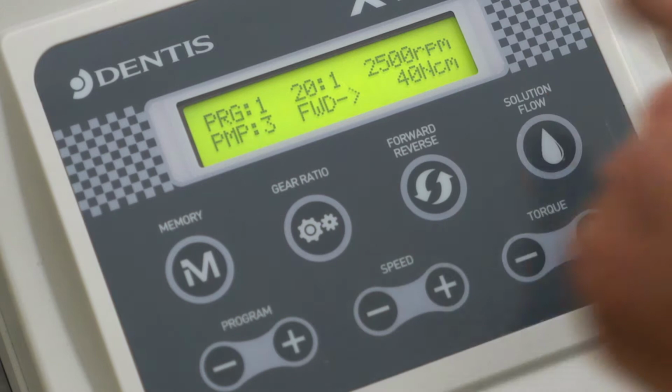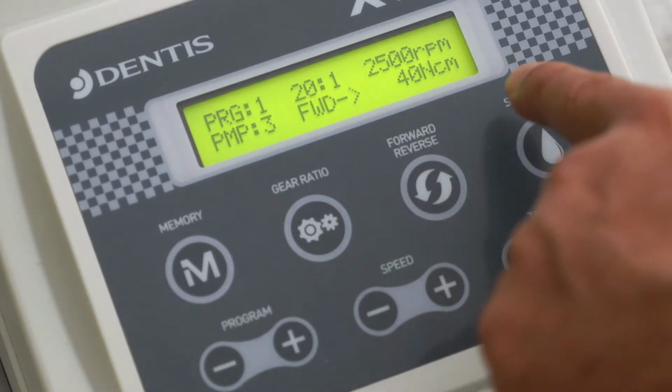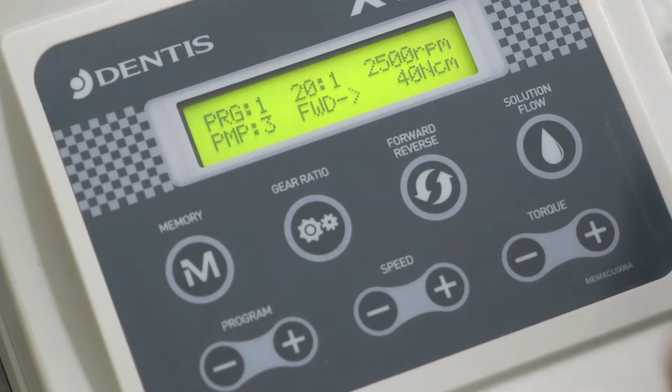Top right is the RPM. For osteotomy, you want the highest RPM that your machine allows you, because the faster you go, the less heat you're going to produce, lower chances of heat necrosis. And your Newton centimeters is the amount of torque that you're exerting. It's set at 40 Newton centimeters. This is my ideal setting for osteotomy.